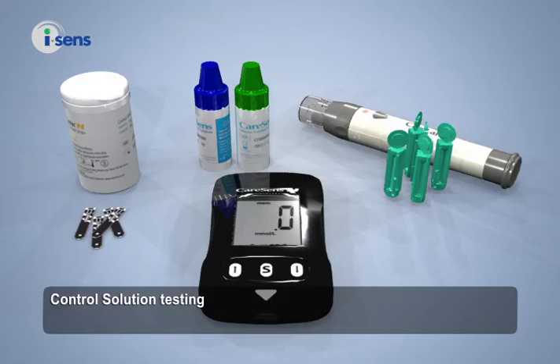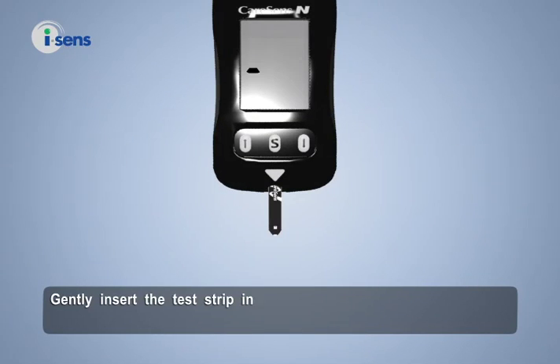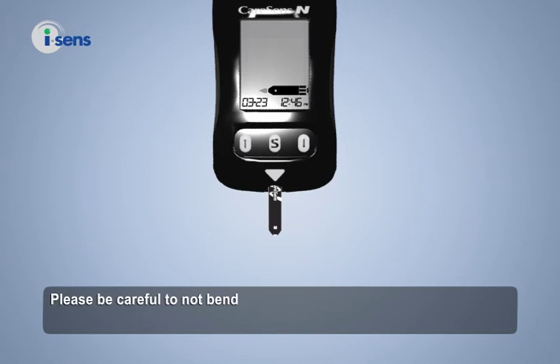Control solution testing must be done between 20 and 25 degrees Celsius. Gently insert the test strip into the meter in line with the triangle symbol and with the CareSense N logo facing up until the meter beeps. Please be careful not to bend the strip when inserting. In a moment the meter will display a blood insertion symbol.